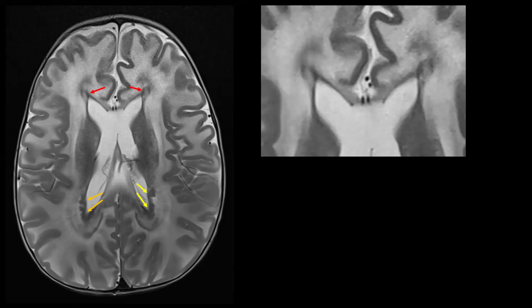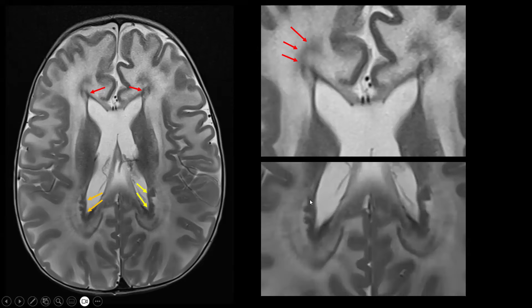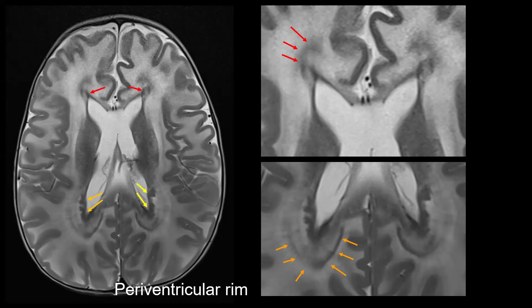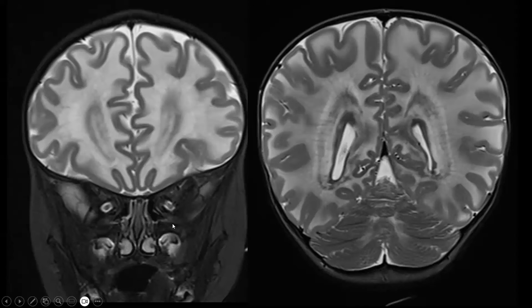We have periventricular abnormalities, but also another rim located a bit more in the paraventricular white matter — still near the ventricles but no longer making contact with them. We see this both frontally and posteriorly. So we have periventricular T2 hypointense abnormalities in direct contact with the ventricles, and paraventricular rims which run parallel to the ventricles but make no contact with them. On coronal images we can see part of the paraventricular and periventricular rim — the periventricular rim making contact with the lateral ventricle and the paraventricular rim running parallel to the posterior part of the lateral ventricles.